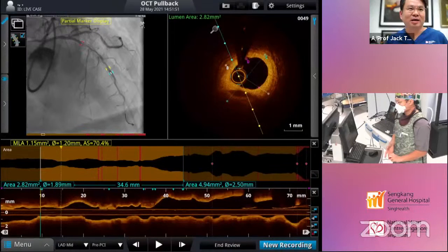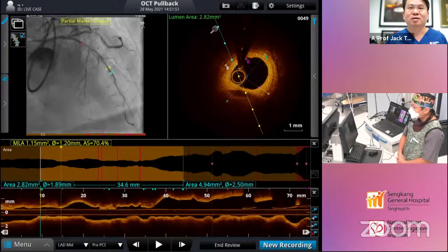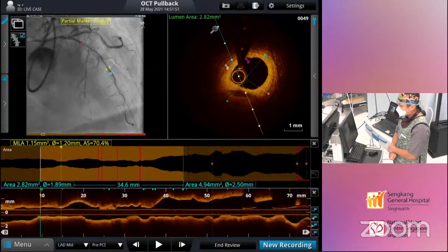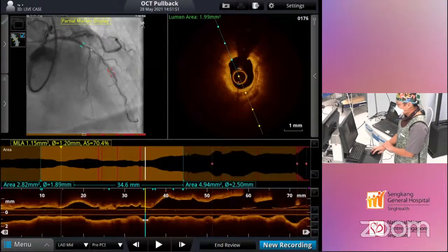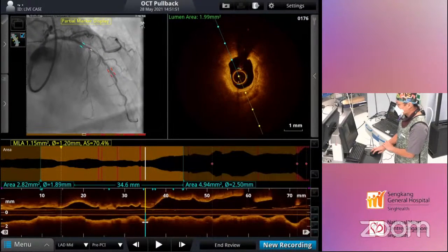Obi-Van, can you unmute the cath lab? I want to see ultimately what Chi-Yang advised and what Dr. Pham has decided to do based on all the discussion on the imaging here. Chi-Yang first, maybe you'd like to tell us what is your recommendation based on what you found? Okay. As I mentioned earlier, although the OCT score is high, this is not objective at all, but just the way the calcium is distributed, it's not so concentric.